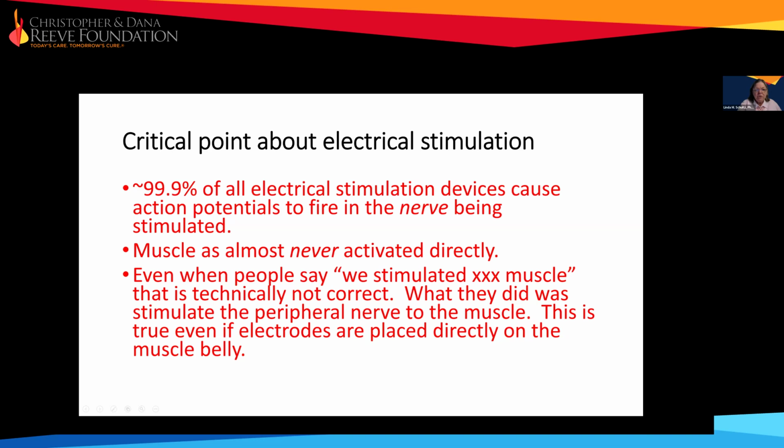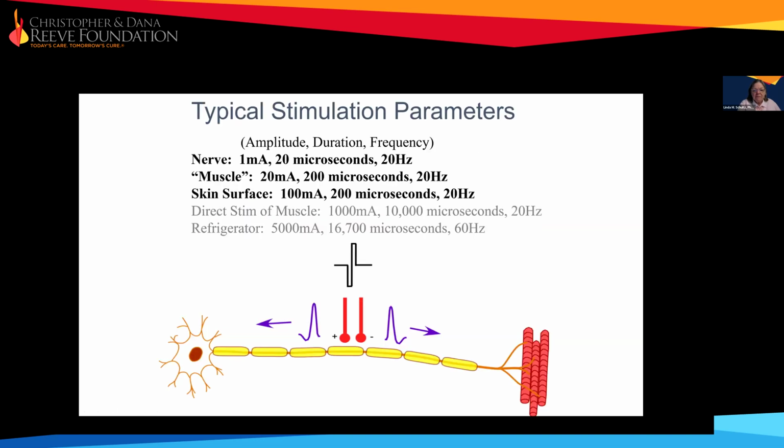So I have a question about your graphic down there. Yes, I'm sorry. Yes. No, that's okay. Um, Down here in the center of the graphic, you have this black line, which is that, yeah, that thing. Yes. Yes. And is that showing the pulse of the electrical stimulation? Is Yeah, that showing how that?